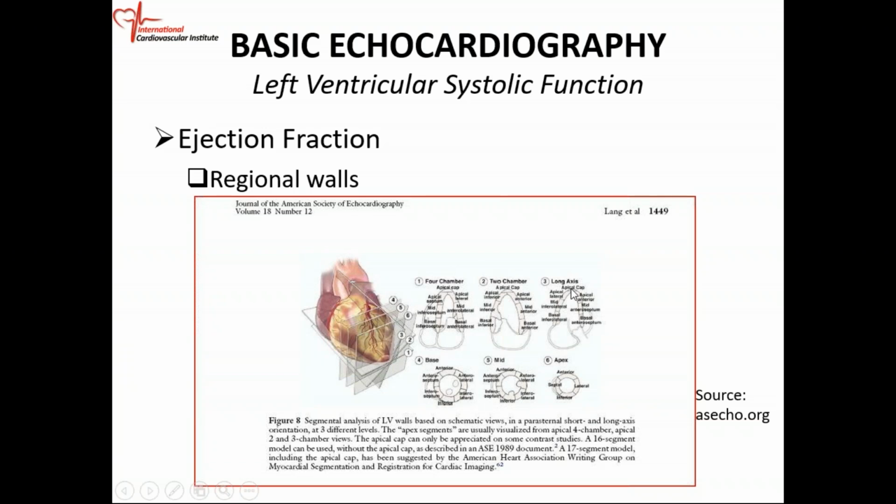So I'm going to let you guys go over this so you fully understand it. And then when we come back, we'll talk about wall motion. We'll talk about the blood supply to the different segments, and we'll talk about wall motion score index. So go over the segments, fully understand the segments, and then we'll add something more to this at our next session.